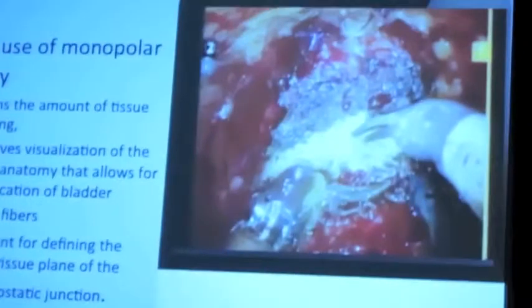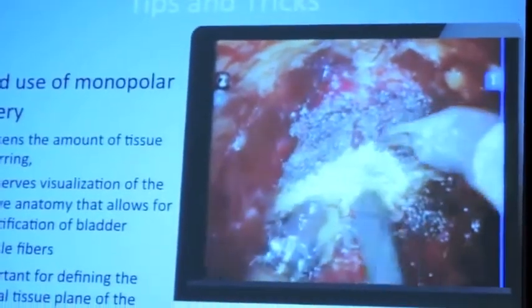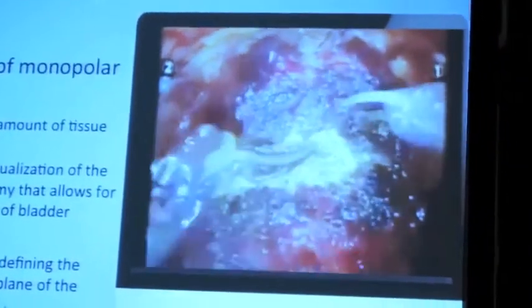And the most important thing, as you saw in the previous video, is to avoid using monopolar cautery a lot. This lessens the amount of tissue charring and preserves visualization of the native anatomy, which allows for identification of the bladder neck. If you use sharp dissection, you have to see the bladder and the prostate exactly, and you have to see the natural plane. I don't use cystography in my bladder neck preserved cases.